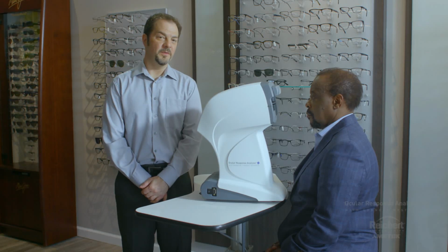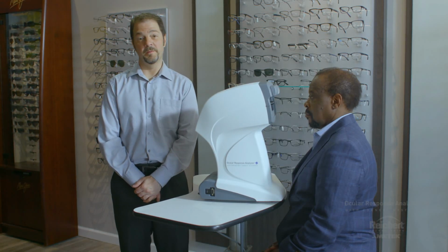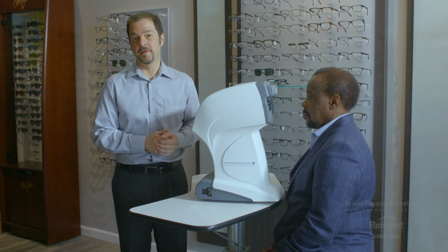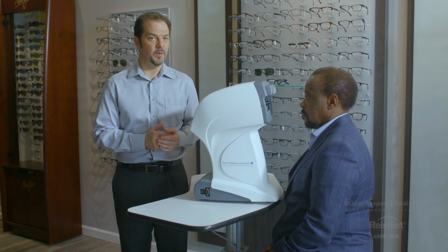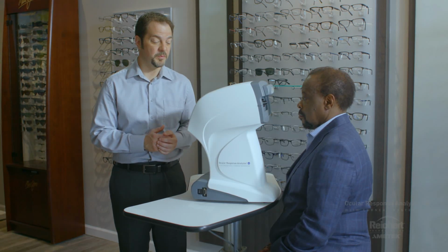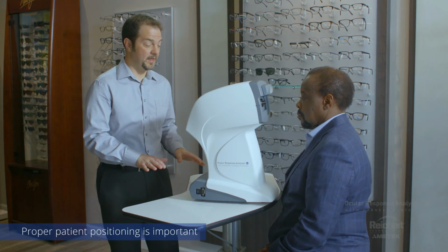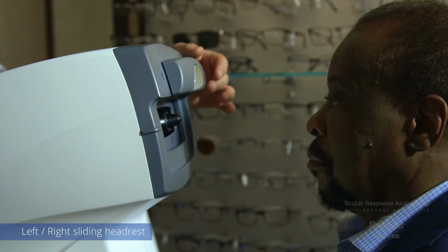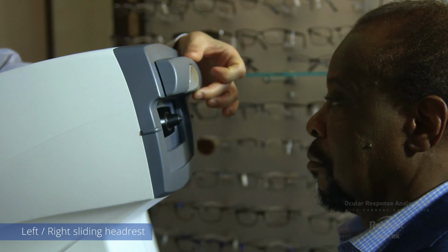Let's talk for a few moments about patient alignment and measurement. First, before the patient sits in front of the instrument, I think it's important to ask them to remove their contact lenses if they're wearing any. Contact lens materials can affect the accuracy of the measurements. You want to make sure you have the table set at the proper height and the patient stool set at the proper height. The device features a left-right sliding forehead rest.